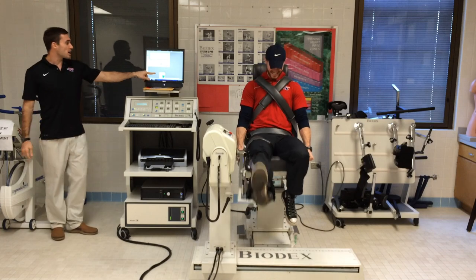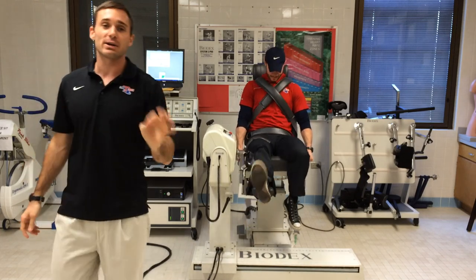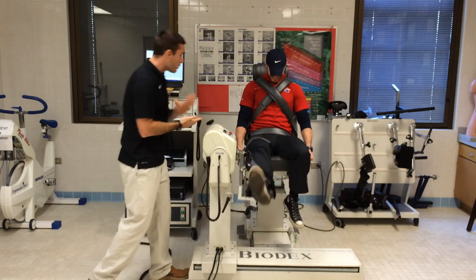We follow his progress right here on the screen. We do not want to tell him where he's at during the test. If we tell him where he's at, it can affect the final results. All we want to do is just encourage him. Just like, come on, Bo, keep going, push that leg.